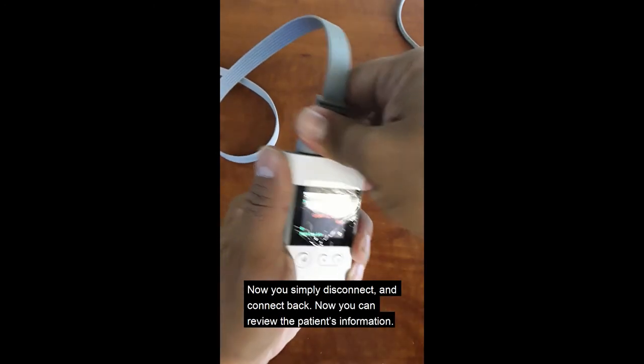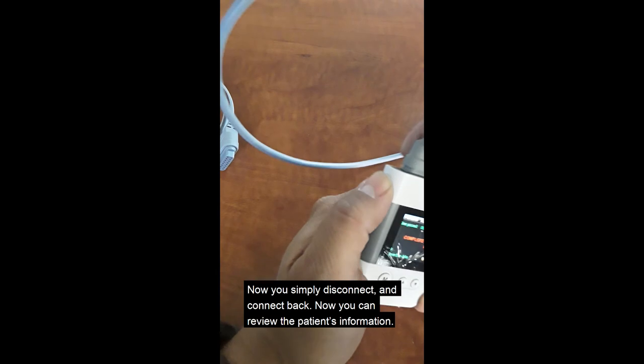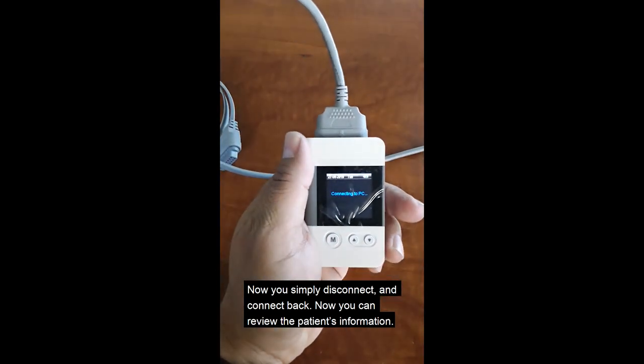Now you simply just disconnect, and just connect it back. Now you can view the patient's information.